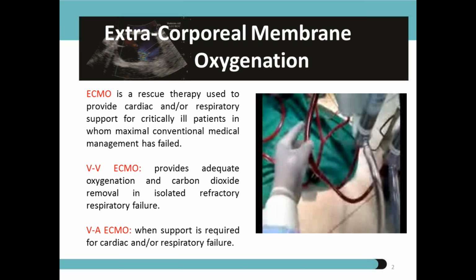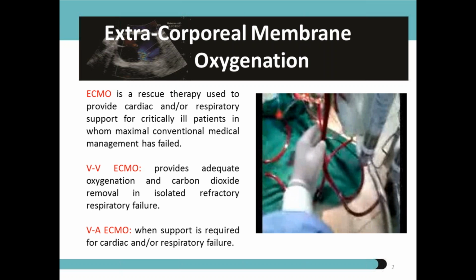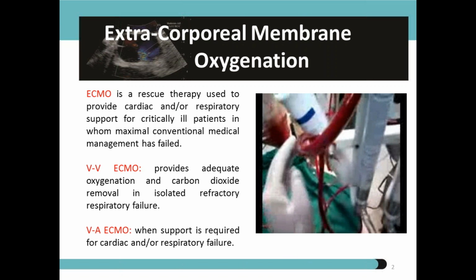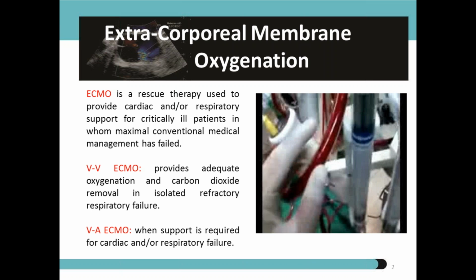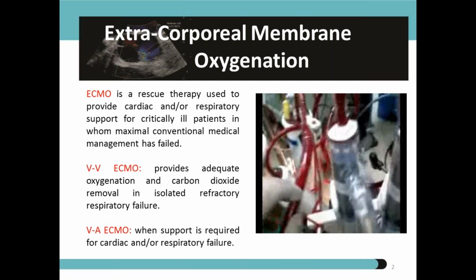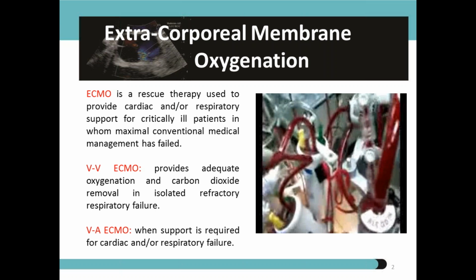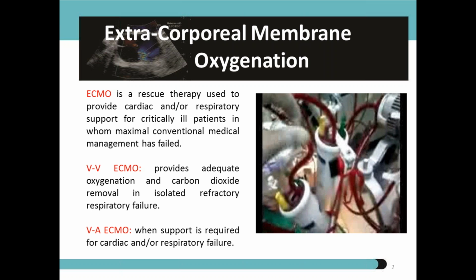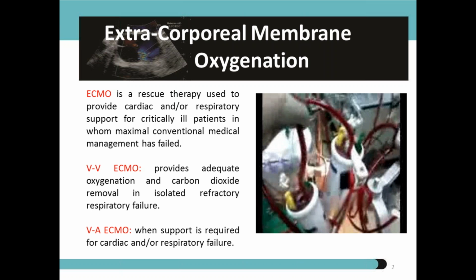All that is done electively, and you come out beautifully on an ECMO and transfer the patient on one detachable. Our ECMO machines, CPB machines have a detachable pump, and the patient is weaned off from this ECMO and the pump within 5 to 6 hours. And we call this the integrated ECMO.